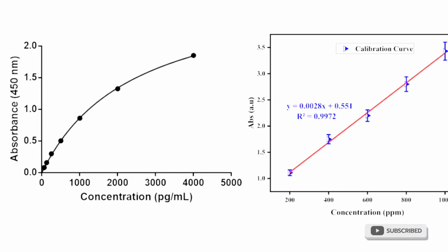So when you look at linearity, you are looking at any result that you can look at here. The highest result it can give you is around maybe 4,000 something. This is where it stops. It's not up to 5,000, okay? So the highest absorbance you have is 2.0, if that makes sense. So if you now get a result that is within 2.0, you can get a concentration. That means it's within the linearity.